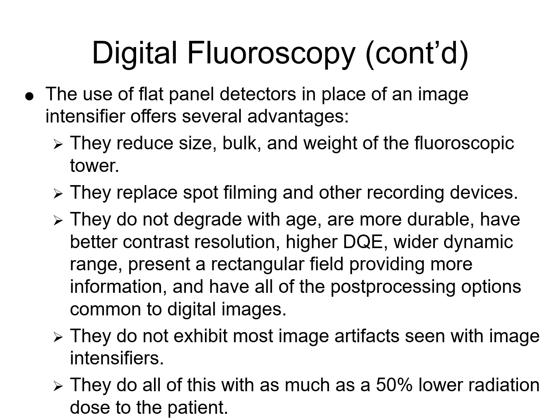It can record a cinematic loop and do a run where it loops video in playback until you stop it and activate fluoro again. It can do last image hold, which is actually a radiation safety measure. It's a radiation savings. It used to be when you took your thumb off the exposure switch that the television screen would go black, but last image hold freezes the last still image that you took when you had live fluoro. Now when you let off the button, it gives you a still image of the last frame that you were broadcasting. And so that actually saves radiation to the patient.